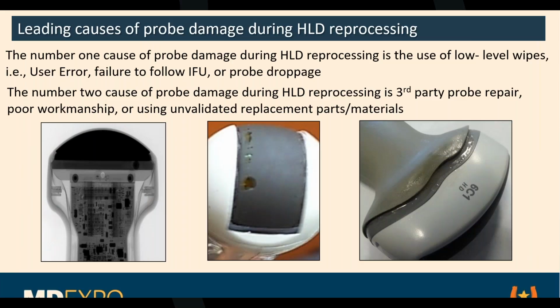That's a CT of the probe over on the far left side, and you can see the lens at the very top there, and then the array, and then electronics. And you know, electronics and moisture don't get along very well, and you can damage stuff here. So this is what happens to probes occasionally, and we'll go into what caused this one. And this was an epidemic for a while.